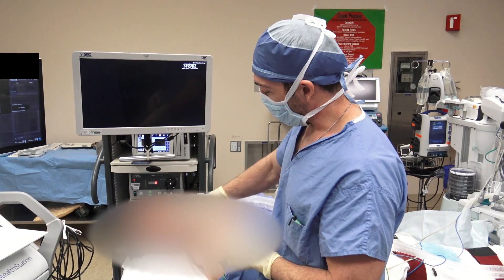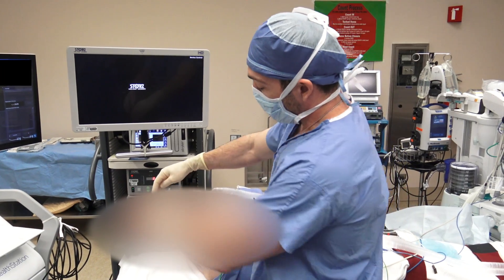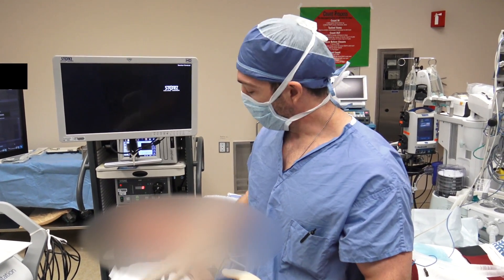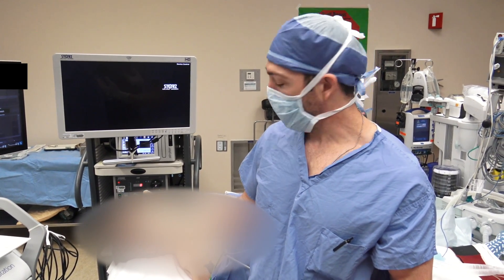We also note that the eyes are covered with tegaderms — clear tegaderms are preferable. These will be exposed during surgery so that as you operate along the orbit, especially in the ethmoid cavity, you can easily palpate the eye to ensure you're not having an entrance into the orbital space.